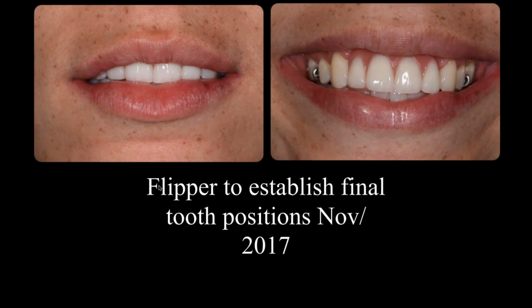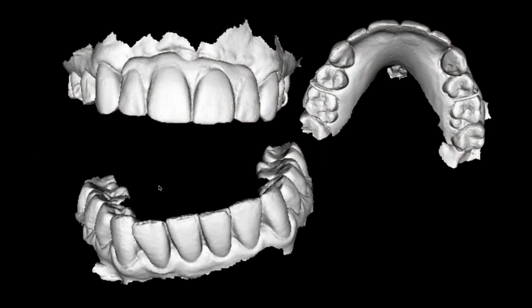So we got her a real good flipper. A very good dentist made her this flipper, which now is giving her a very, very good sense of proportions of where the teeth need to go and her needs. So she's very, very happy with where she is right at this moment. Still devastated by the injury, but not bad. So now we have this flipper. I imaged this on her in her mouth. And by doing that, I now have an image of where the teeth need to go, because now I have the right setup. See, you have to have the right setup.